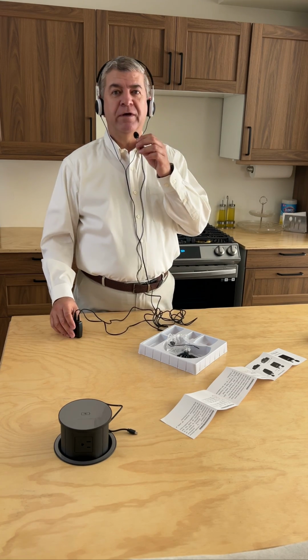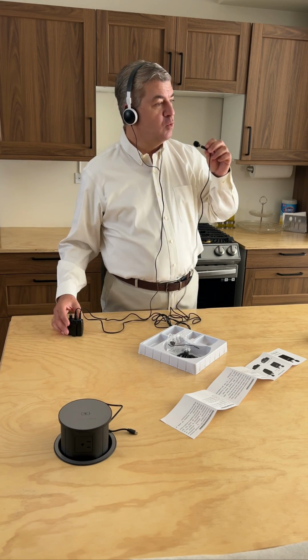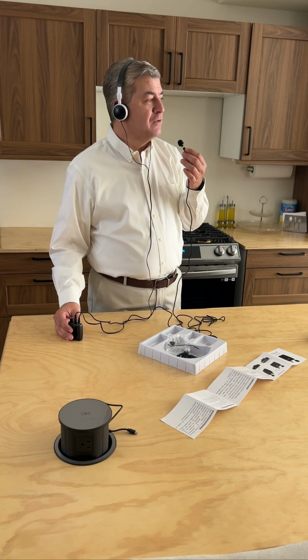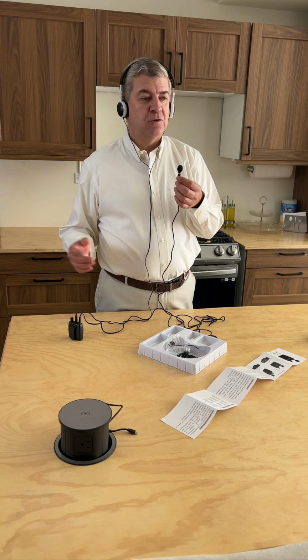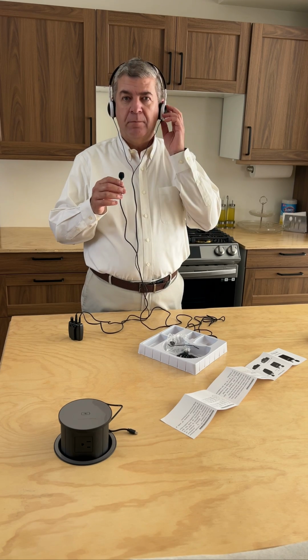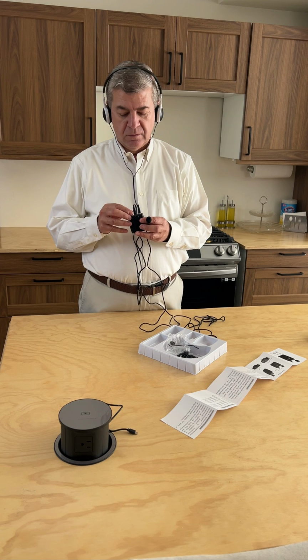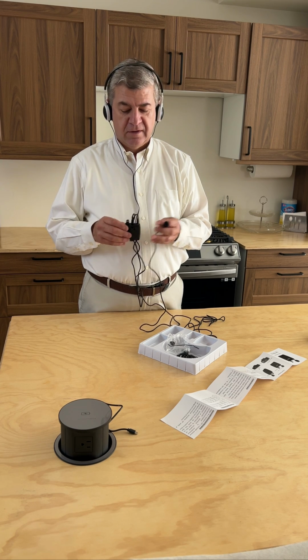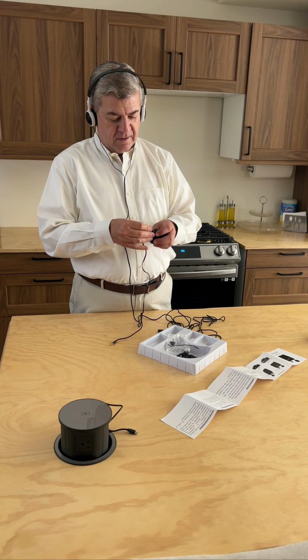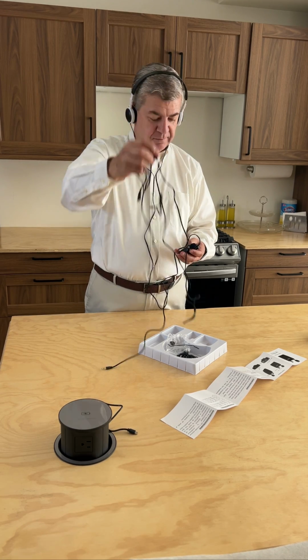If you want to hear the TV and the TV set is far away, you can use this cable to get the microphone to where the TV is. Or if you are at mass or in a public hearing, whatever, and you want to hear louder, this equipment will help you. So you have the volume, and the microphone can be directly in the adapter or in the extension cable.